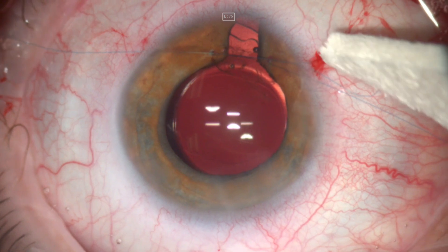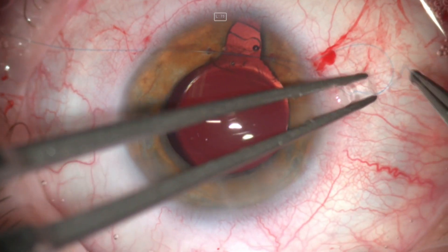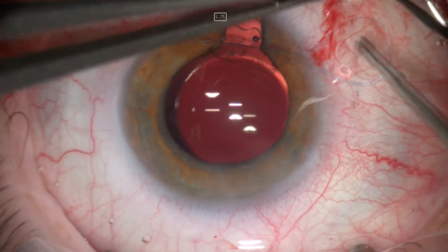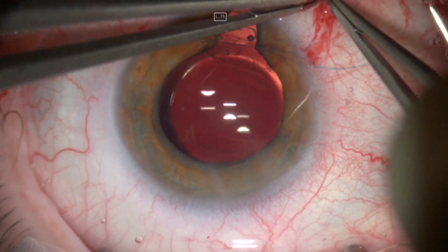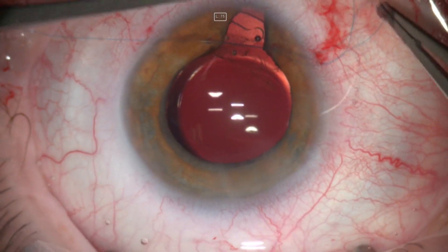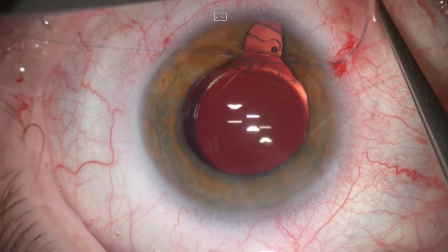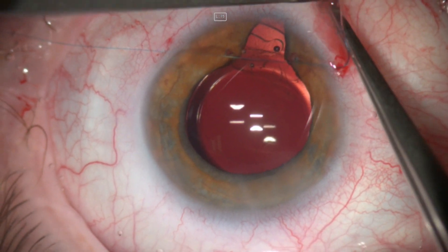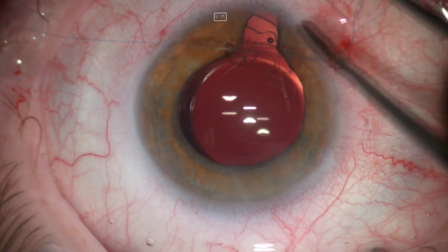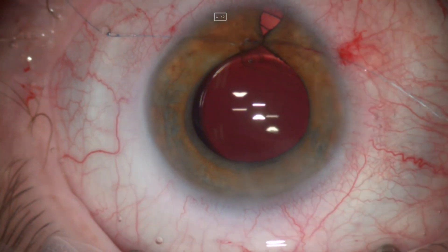After that, you grip the distal part of the suture and externalize it to prepare for the four throughs. Then you cut the proximal part and make at least four passes through the loop — one, two, three, and then the fourth. It's always useful to use higher magnification for this step. Once the four throughs are completed, you pull the sutures, which brings the iris tissue together.